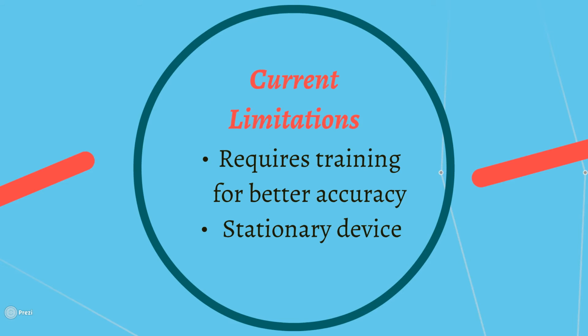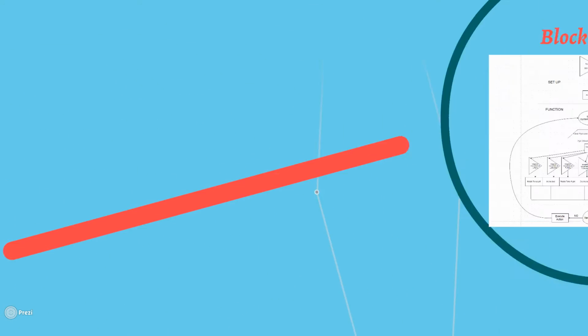The limitation of our device is that many hours of training are needed to acquire accurate signals. Also, the current design consists of a stationary bed. In the future, we hope to add wheels that the user will be able to control with other EEG signals.